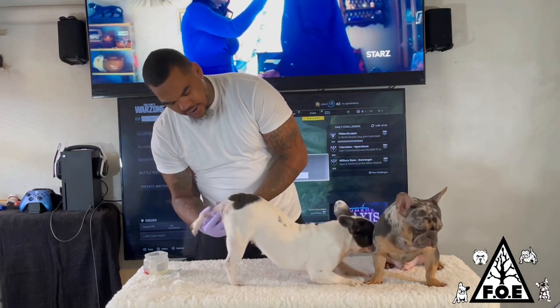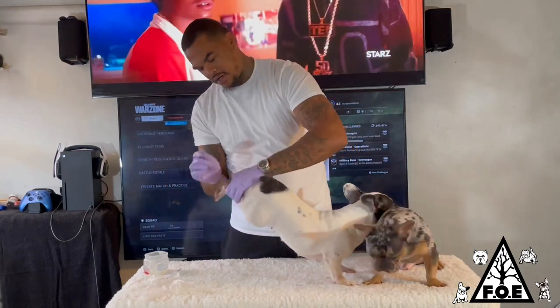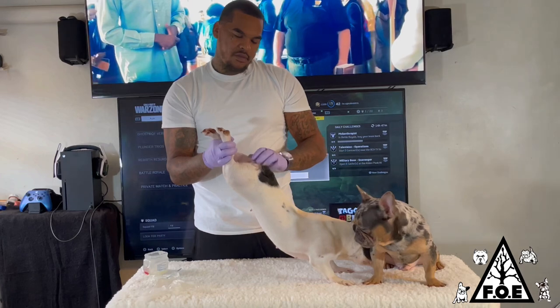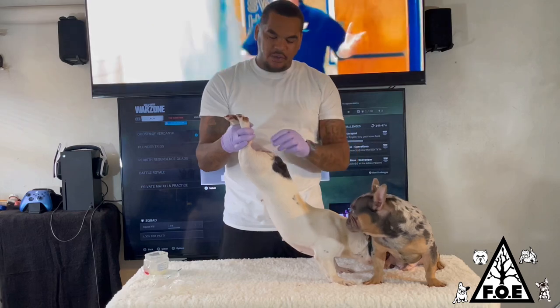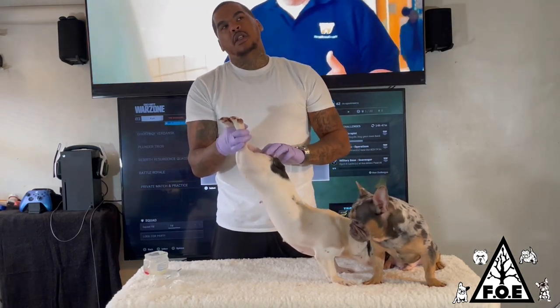Sometimes you can take the female and put her in this position right here, hold her upside down like that too. Basically just let it open and close and let it flow in. We're going to see — I'd say about the last week of December we should have puppies.